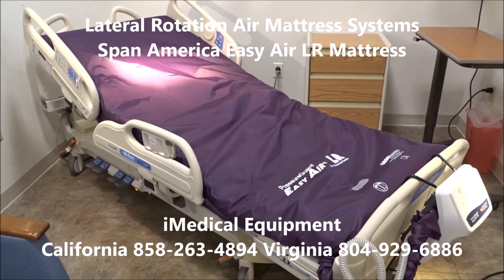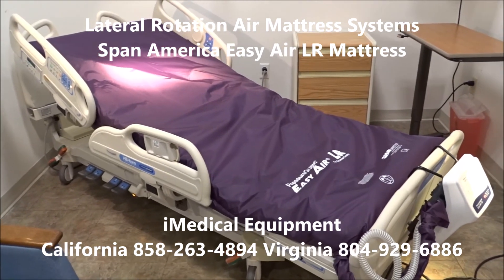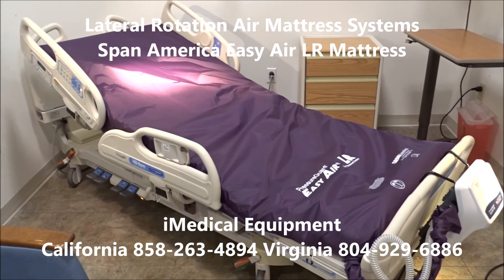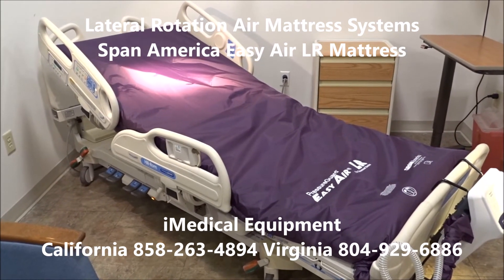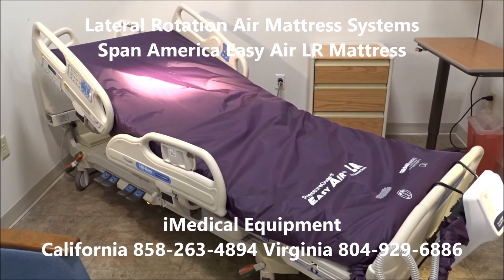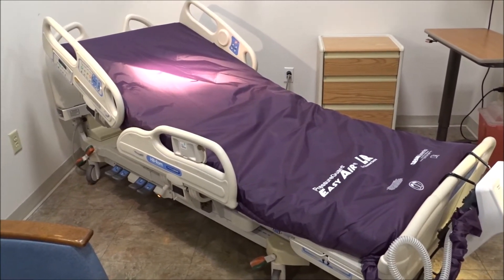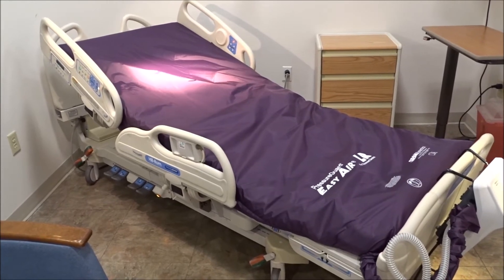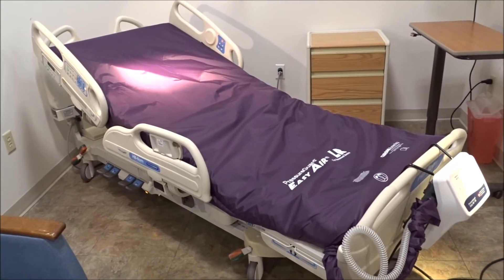If you're looking for an air mattress system with lateral rotation and a bed system set up to treat and prevent bed sores and pressure wounds, this is one of the best ones you can purchase. Whether it's for home use, hospital use, or whatever it might be, this is one of the best systems available right now, and it's all made in the United States.